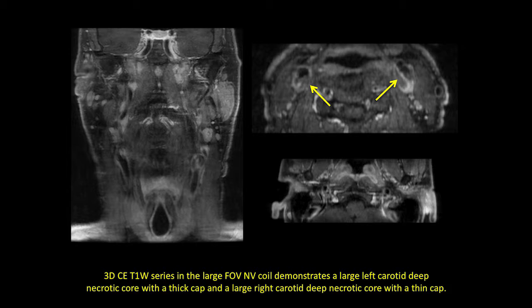We got to use clinical sequences, clinical coils, no fancy software to analyze, and then let's ask a couple of good questions. So part of this was, okay, most of the major manufacturers now offer a 3D fast spin echo, variable flip angle T1 weighted sequence. So let's try using that before and after gadolinium, and let's see how it correlated with our research images. And I don't have time today to show you, but basically they correlated very well when the plaque components were identifiable and fairly large. If they're only on one slice, hard to see.